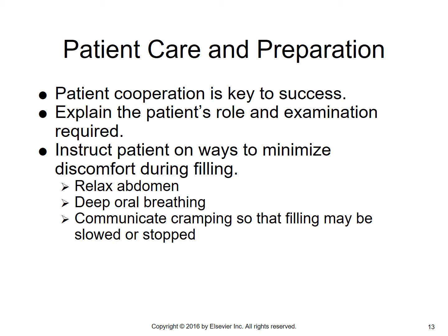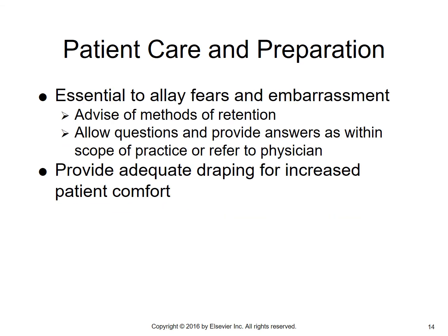A lot of times the patient will start to complain. The radiologist will tell you to turn the barium off. Without the barium flowing, sometimes that allows the colon to just kind of relax. It's essential to allay any fears or embarrassment for the patient. Advise different ways of retention. Like I said, tell them they can deep breathe. Allow questions and provide answers within the scope of practice, or refer to the physician, and then provide adequate draping for increased patient comfort.